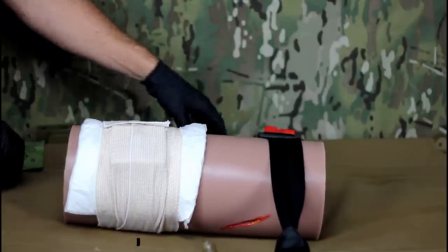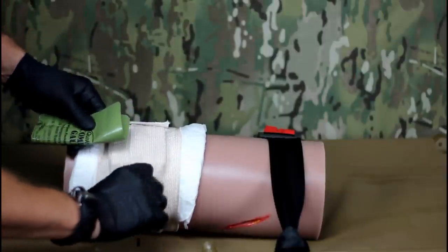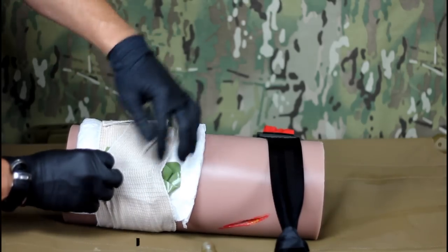Once the dressing is secured, tuck the empty combat gauze package into the outer wrap to alert receiving medical personnel that combat gauze has been used.